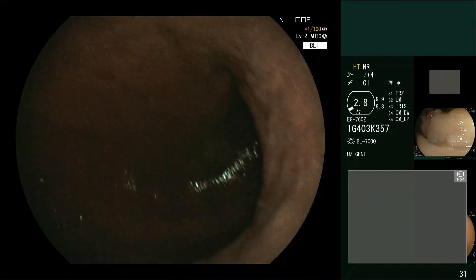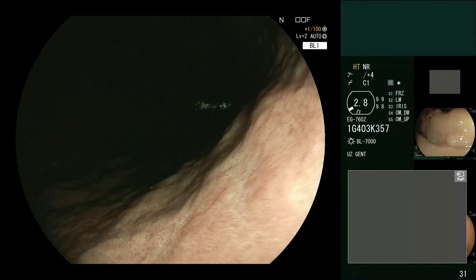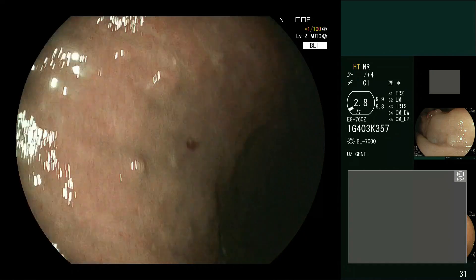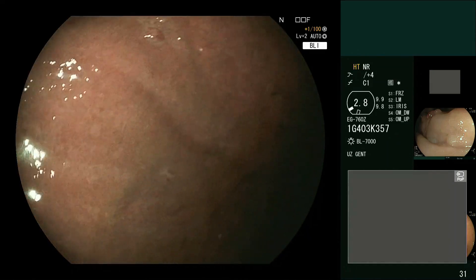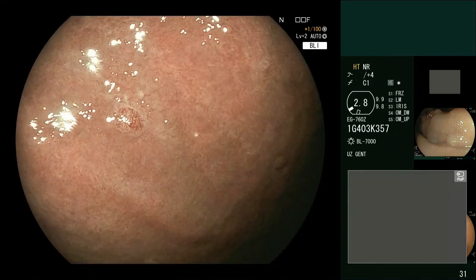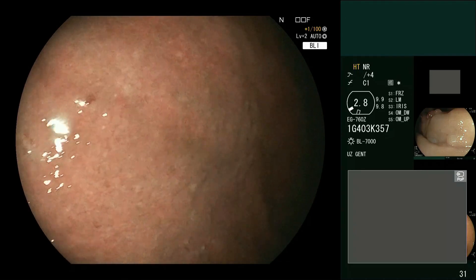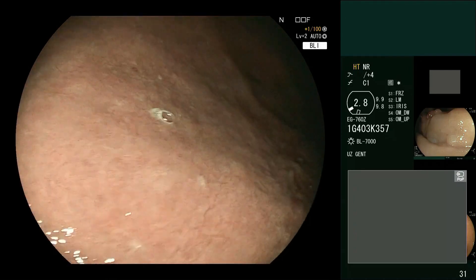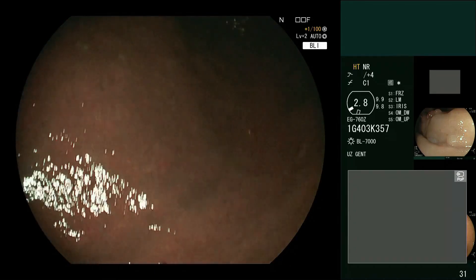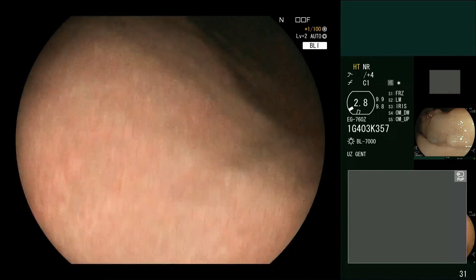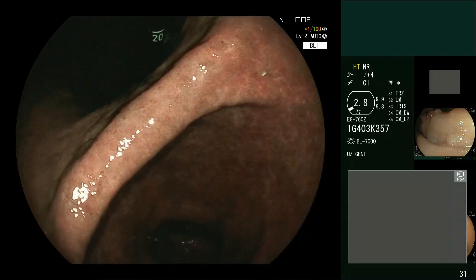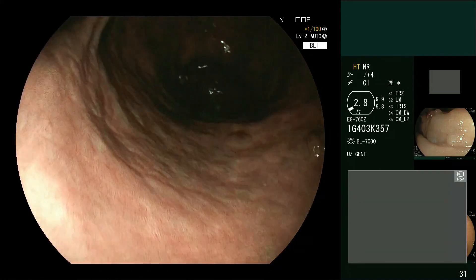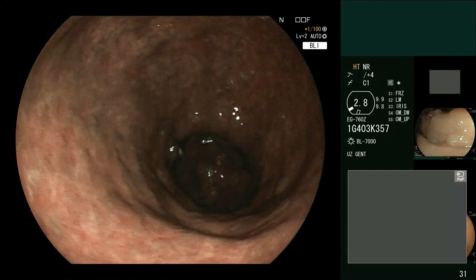I wonder if we can find any more neuroendocrine tumors in here. They do have a very characteristic appearance. I don't obviously see any right now. They are just a marker of the presence of atrophy. Right now we don't see any.